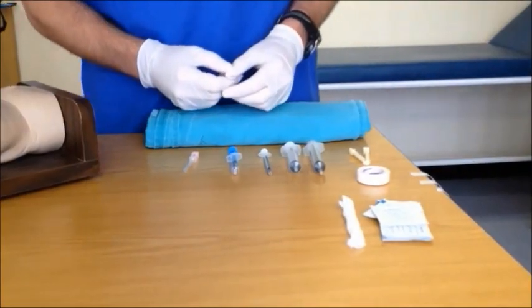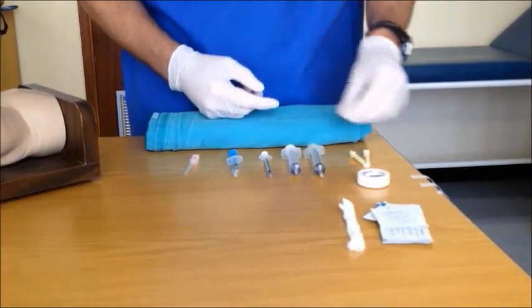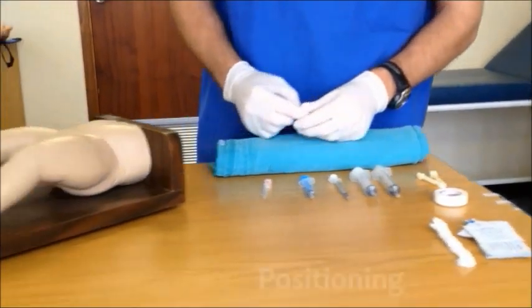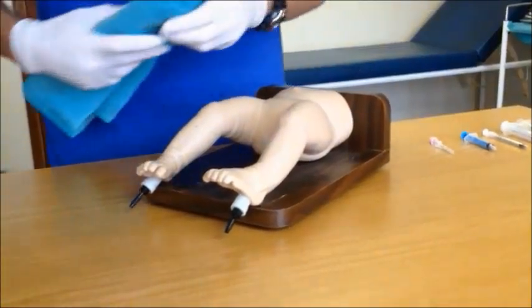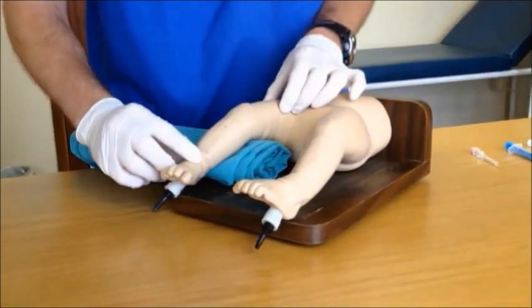Although there is no one excellent way to secure intraosseous access, we will show you one technique that uses an umbilical clamp, some tape and gauze. The first step when inserting an intraosseous line in a child is to position the child correctly. The child should be on their back with a blanket roll behind the knee to keep the leg gently flexed.